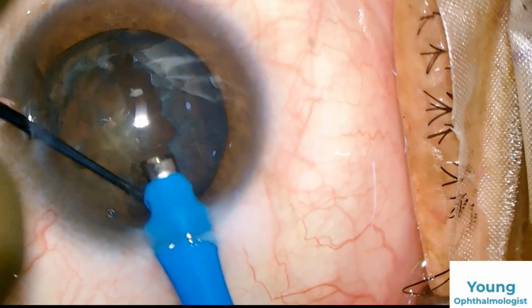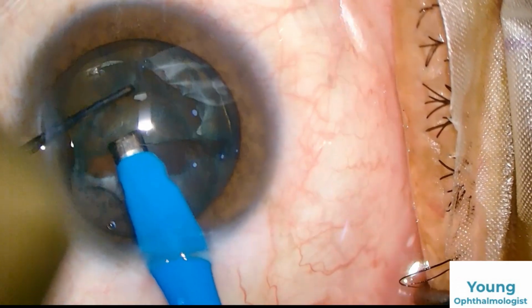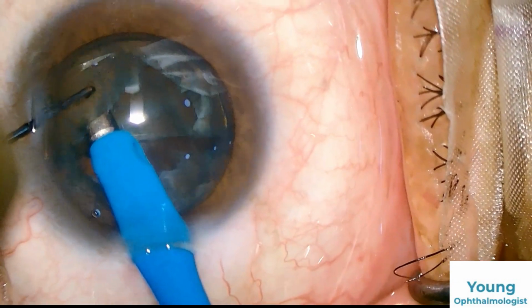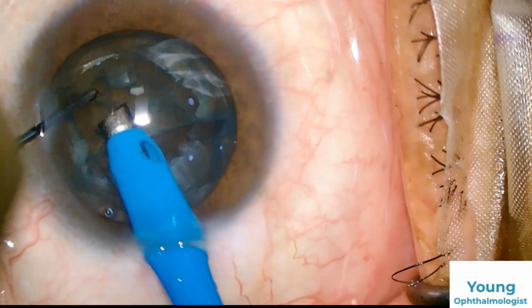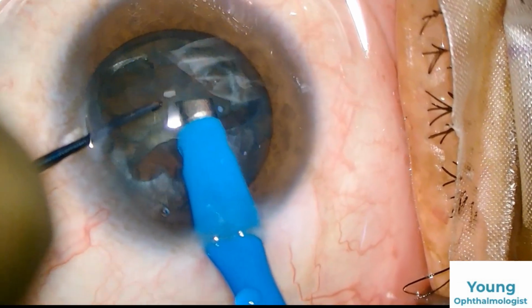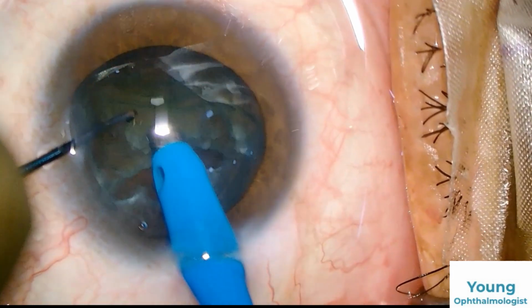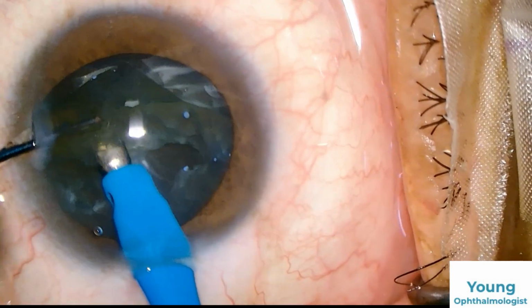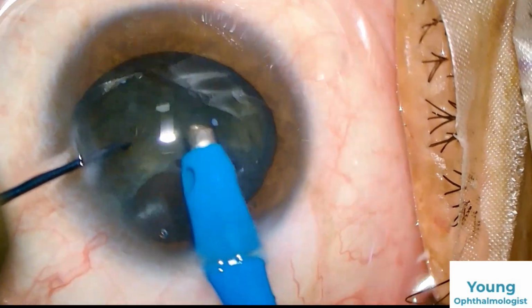We are in phaco 2. The vacuum here is 380, power is 50 and flow rate is 45. It is the other part of the nucleus. We are emulsifying. There is a small cup formation, so I am trying to lift it carefully and bring it into the center. Now emulsified and will slowly aspirate it.